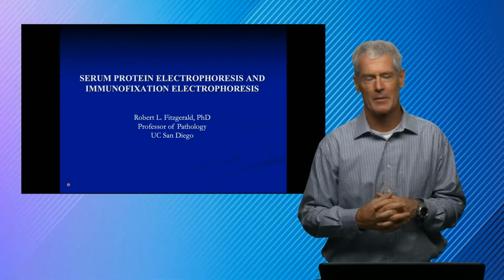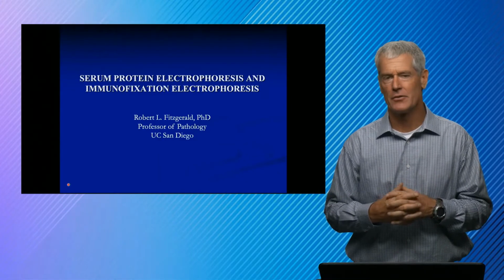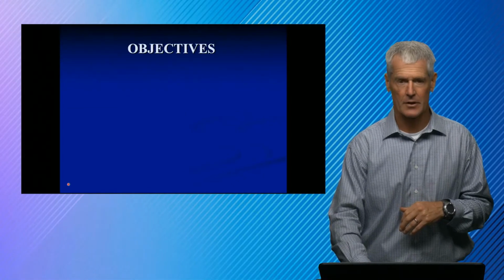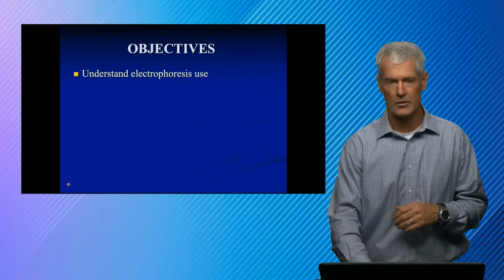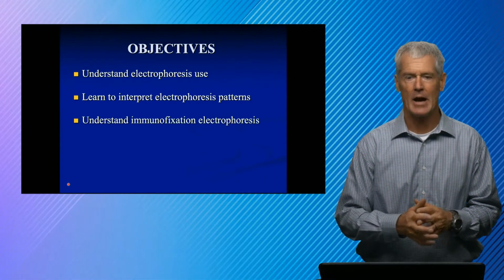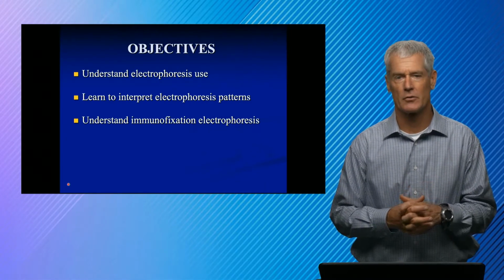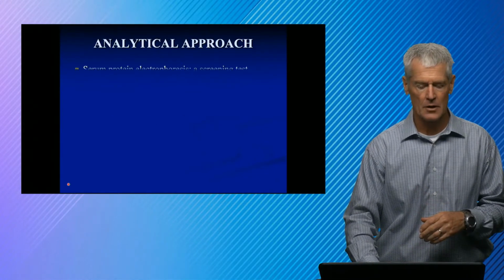We're going to spend about 20 minutes talking about serum protein electrophoresis and its companion diagnostic, immunofixation electrophoresis. Our objectives are to talk about how we use electrophoresis in the clinical laboratory, how to interpret basic electrophoretic patterns, and how we combine SPEP, serum protein electrophoresis, with IFE, immunofixation electrophoresis.